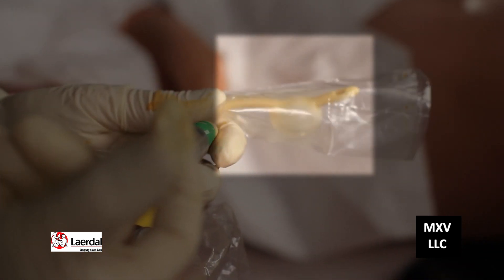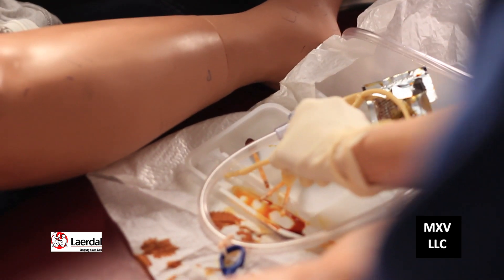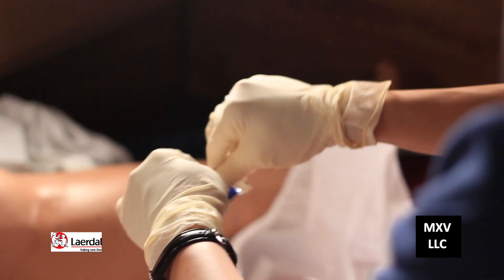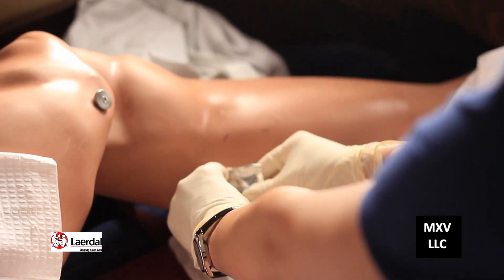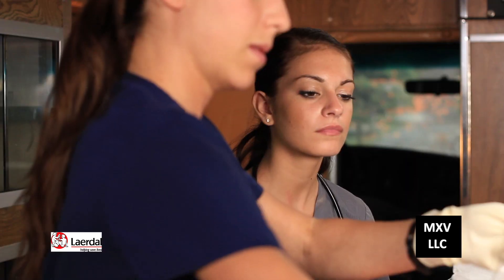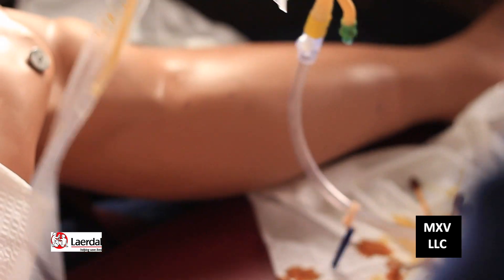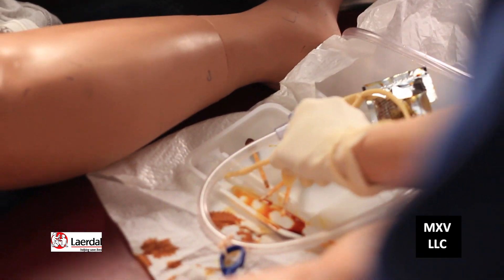Go ahead and gently inflate the balloon — see it blowing up? Usually about 10 cc of fluid. Now deflate it. The next step involves applying lubricant to the catheter tip. Take the lubricant and squeeze it out into the tray. Pull the protective cover off and lubricate the tip of the catheter about four to six inches down. Leave the lubricated catheter on the sterile field.